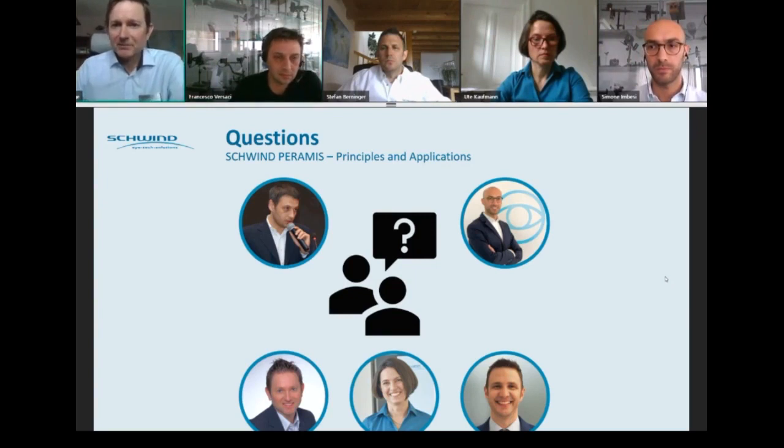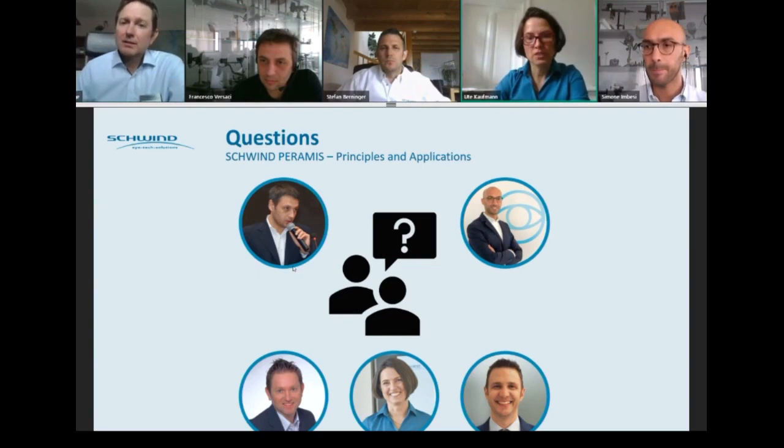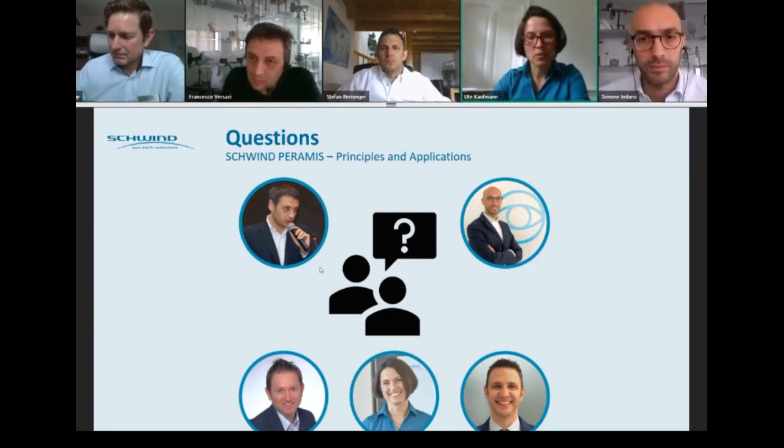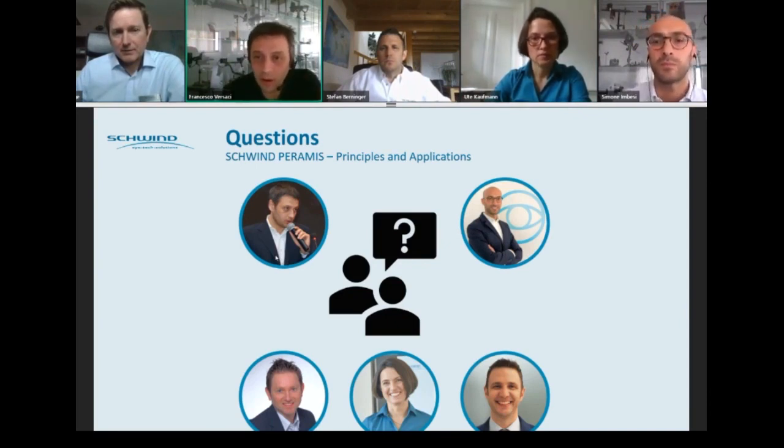All right, thank you. Then, in our questions, we have once more a question to Francesco regarding the IOL tilting. Maybe you can explain once more how to detect the tilt, or maybe how to use the IOL tool.